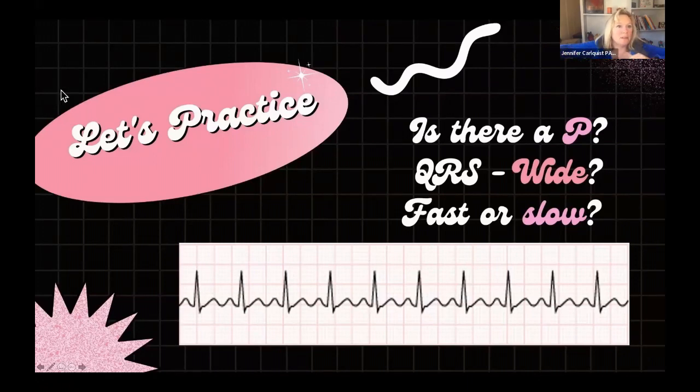And the other thing that I wanted to tell you is with sinus tach, it will usually give you at the top of the 12 lead a calculated PR, where this would usually give you an asterisk if it was SVT or 2-to-1 atrial flutter.